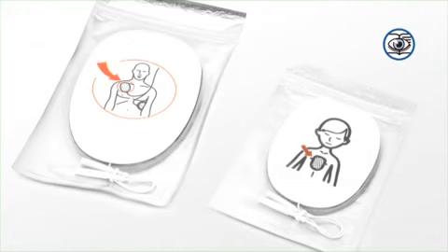Some manufacturers do supply pediatric shock pads for use on children under 8 years of age. This is fine, however, non-availability of such pads should not prevent rescue attempts being made with adult pads.